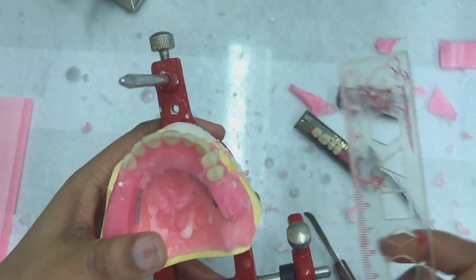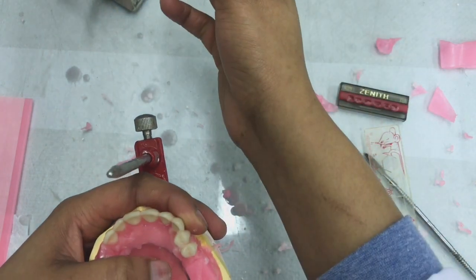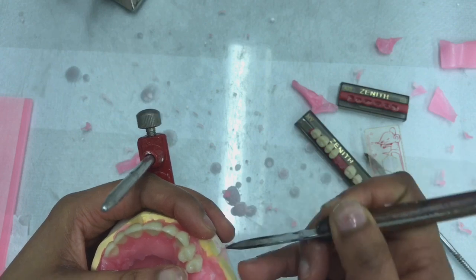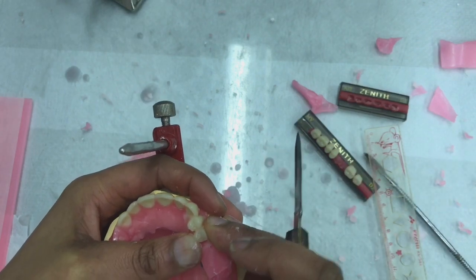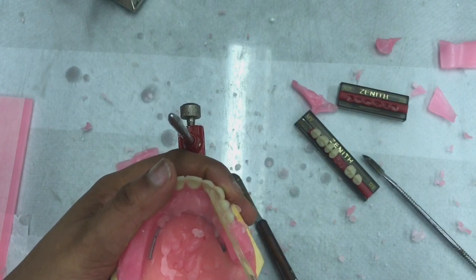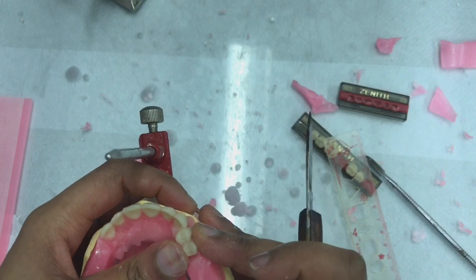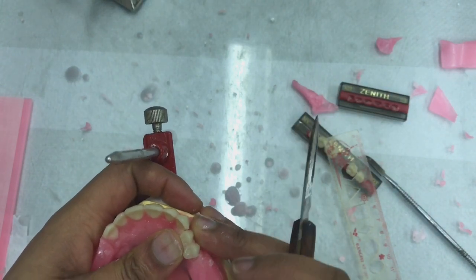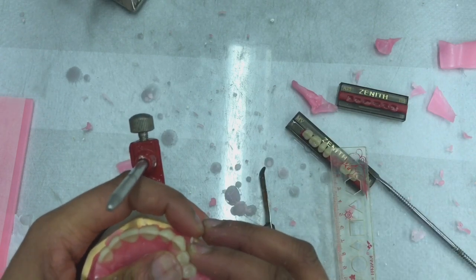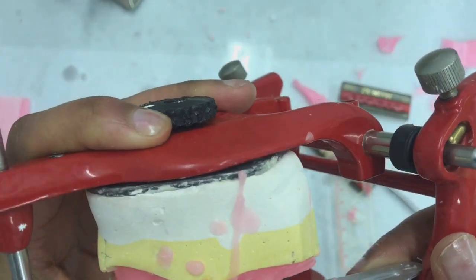Okay, so I'm just going to check the position of my tooth. Okay, I just need to move my premolar a bit more in. Still need to move it a bit more in and twist it. Right. Okay, so I'm just going to double check the position of my teeth. That looks fine.